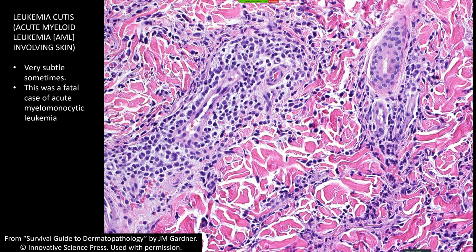I'm always very worried, because I think histiocytoid Sweet's and leukemia cutis can sometimes be very difficult to tell apart, if not impossible, microscopically. So anyway, just to throw that out there, it's an important thing to keep in mind because you don't want to overcall it, but definitely it's one of those things that's very challenging. I'm certainly not an expert on that, but you can go read some more about histiocytoid Sweet's because it can be pretty scary looking.